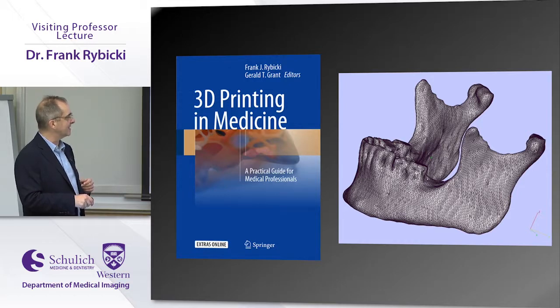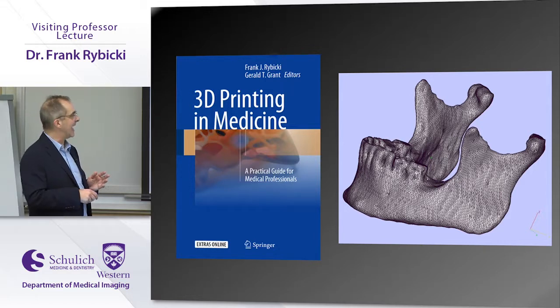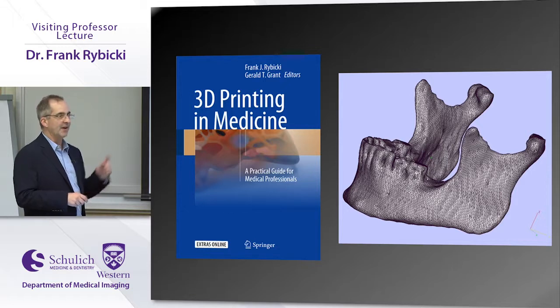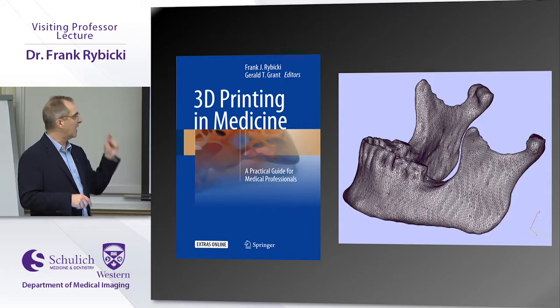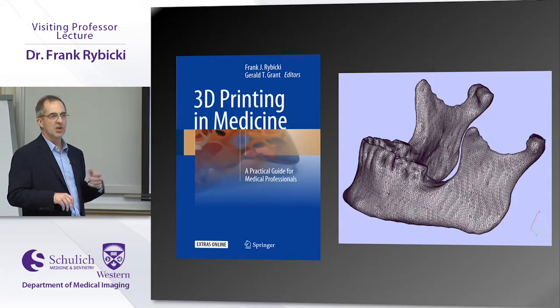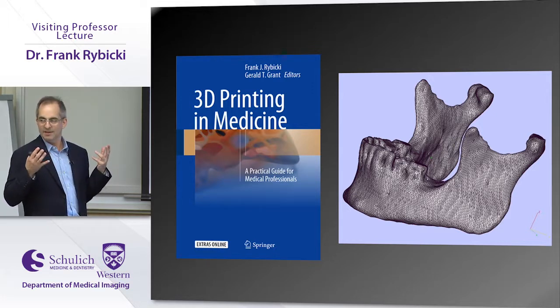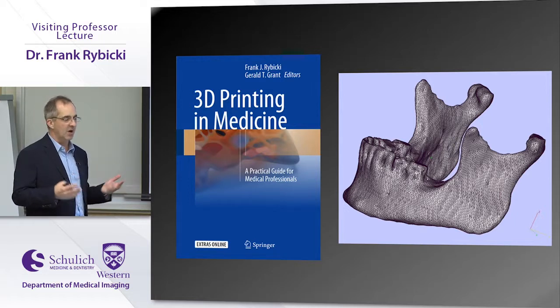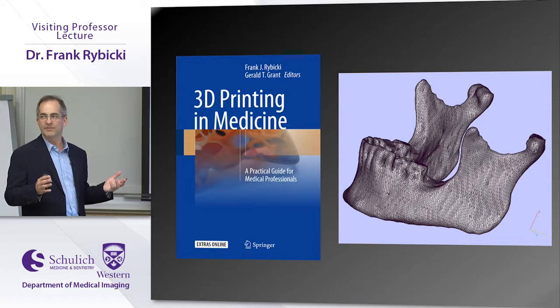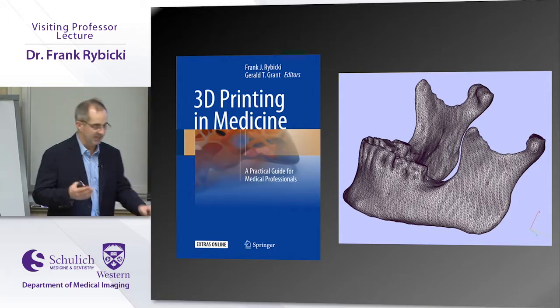making an STL file. This is actually a DICOM image that was converted into STL, and you see all the tiny little triangles in the closed surface. This is a file format that you can send to the 3D printer and give to the maxillofacial surgeon, and they can actually drive a screw through it if it's the right material, and practice whatever they need to do on the model before going into the patient. And like I said, as soon as you give them one, prepare to be giving them for life, right? Because that's just the way that it changes everything.